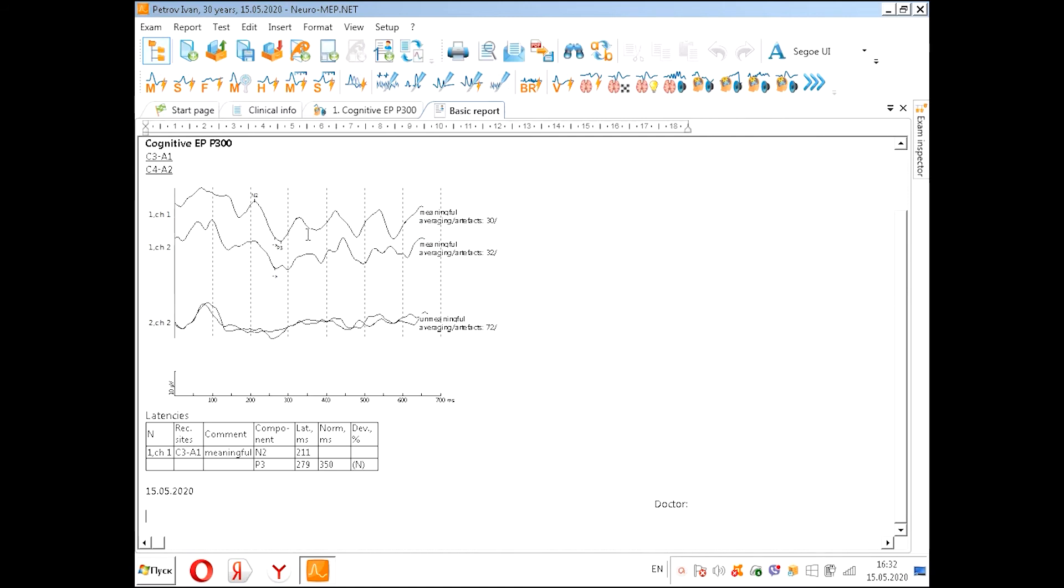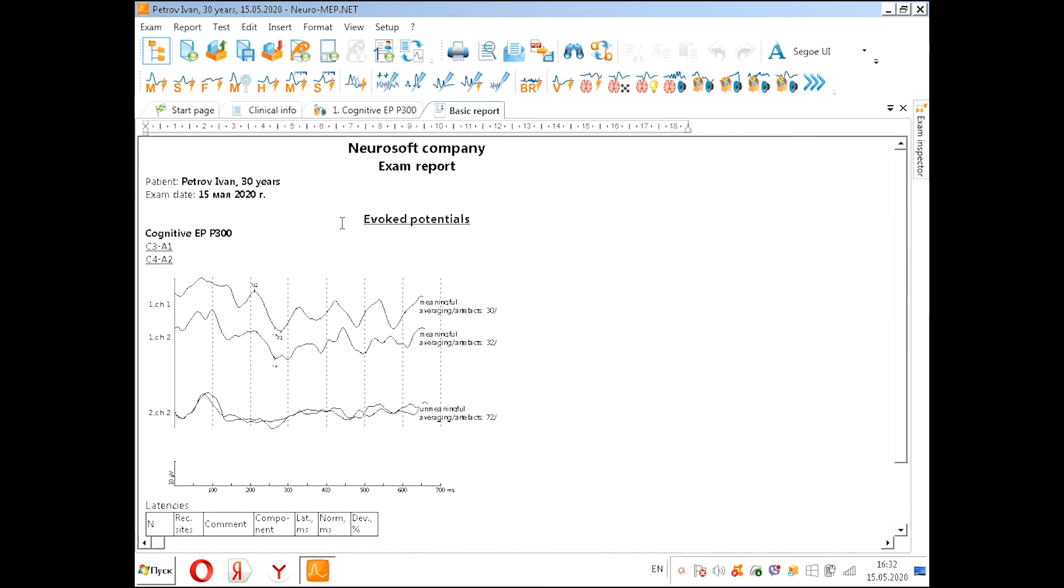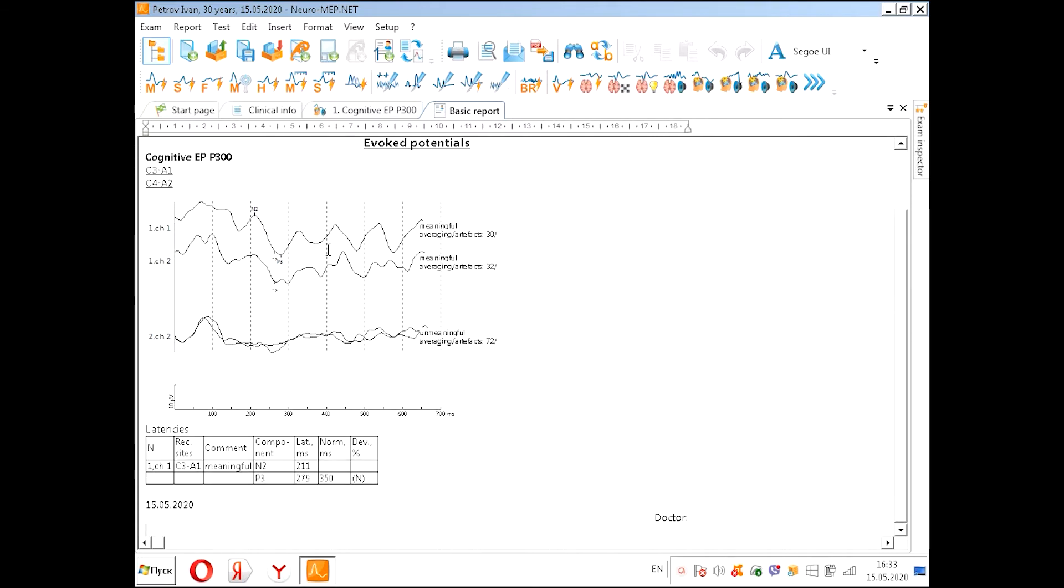We see in the report the name of the patient, the age, the exam date, the curves as we put them on screen the same way, and the details about the latency.